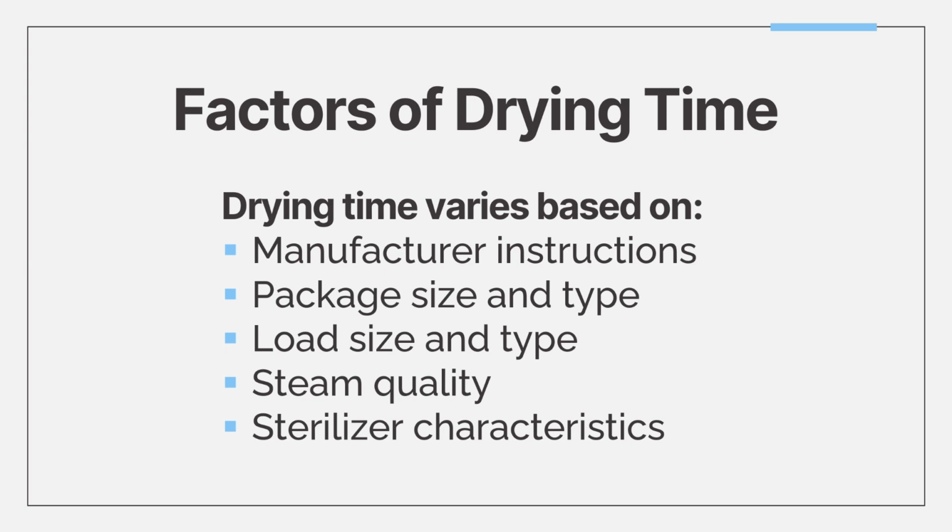All right, so now we have factors of drying time. So it's critical to maintaining sterility and preventing contamination. So there are several factors that influence how long this drying phase should take. And it always starts with the MIFU, for example. So you have to always refer to it for recommended drying times. They are device specific sometimes and based on validated testing to ensure devices remain sterile and safe to use.